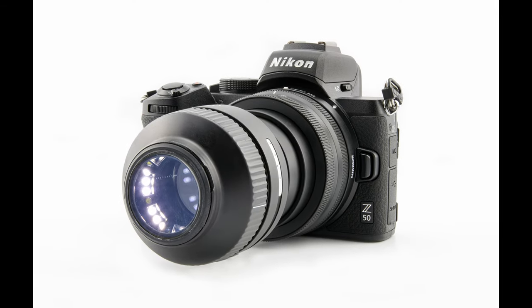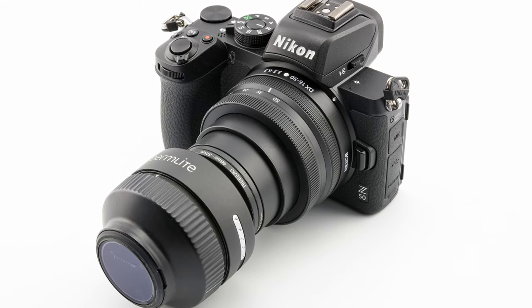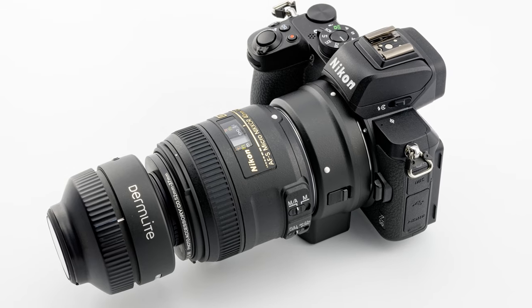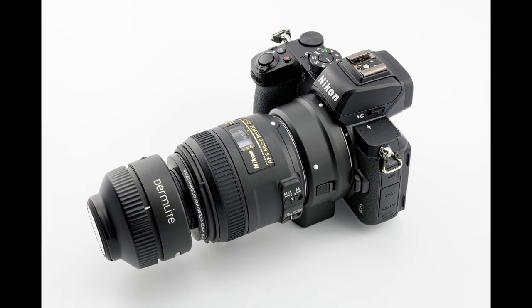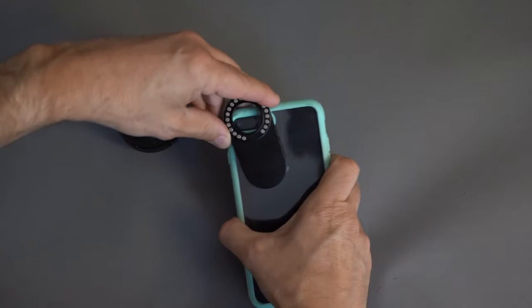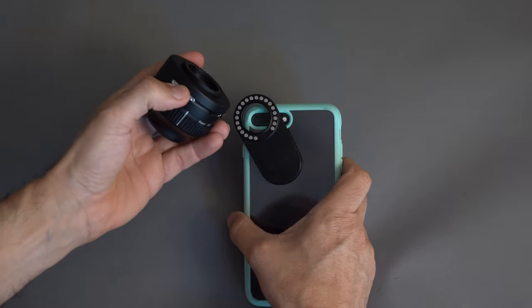Every now and then I get contacted to ask me about the gear I use for my dermatoscopic images. Before going on, I'd like to point out that I don't have any conflict of interests. I use the DermLight Photo X as my main dermatoscope and I attach it to an iPhone 8 Plus with the magnetic connect adapter.